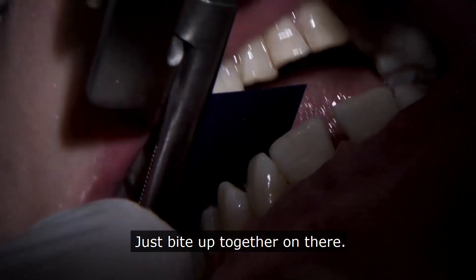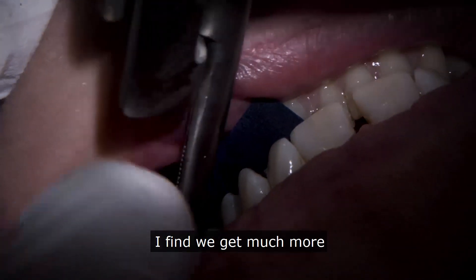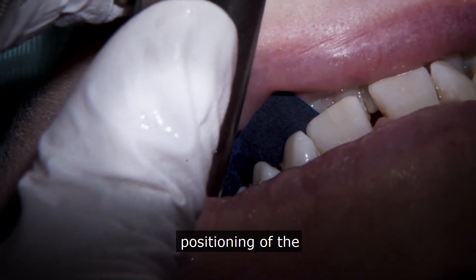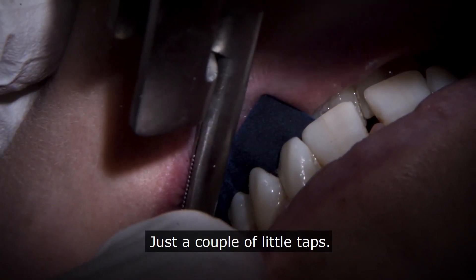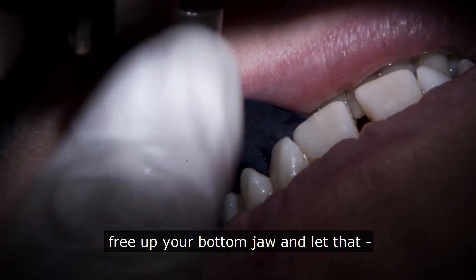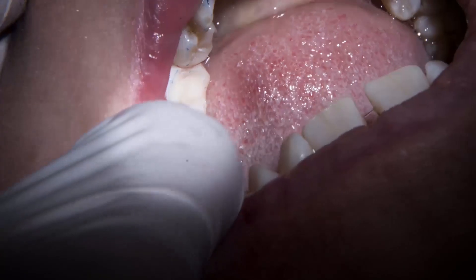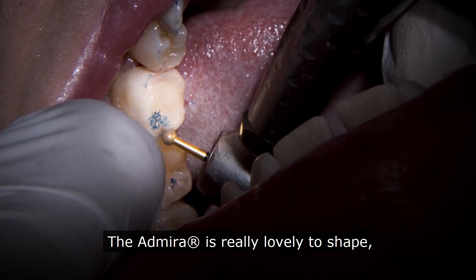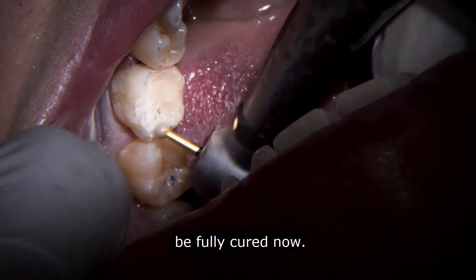Just bite up together on there. I much prefer the slightly thicker articulating paper — I find we get much more accurate positioning of anything that's high. Just tap up and down again, and then with the teeth together, just try and slide from side to side — free up your bottom jaw and let that rub over each other. The mirror is really lovely to shape with, and just taking it — obviously fully cured now.